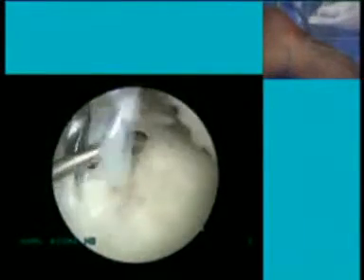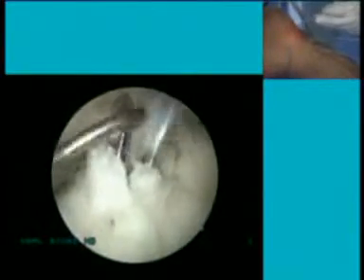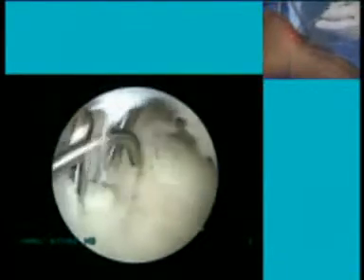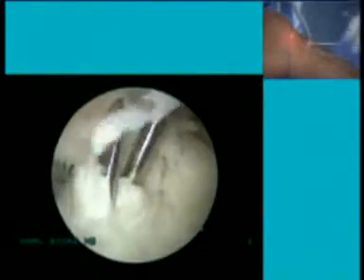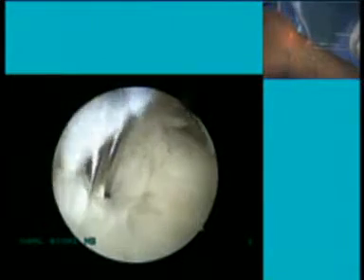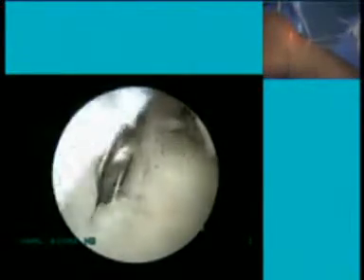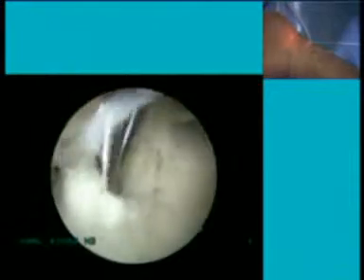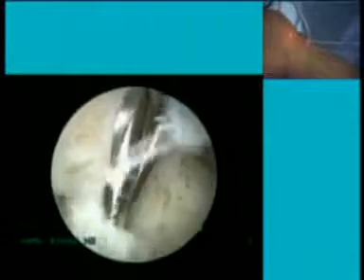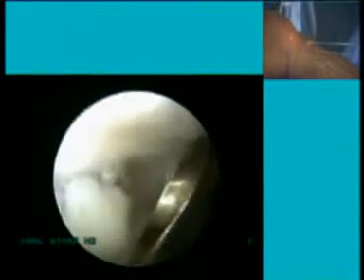Yeah, so there is a tibial confluence here, I'm afraid, isn't it? Yes. One is like this and one is like this. And here's the anterior horn of the lateral meniscus, the posterior border. And here now is my PL tunnel and this is my AM tunnel, the middle. Because this is the anterior border of the AM tunnel. Yes, but we have a little confluence. Okay. Maybe then I will clean it. Can you give me a hook? Or a retractor? And a knife?